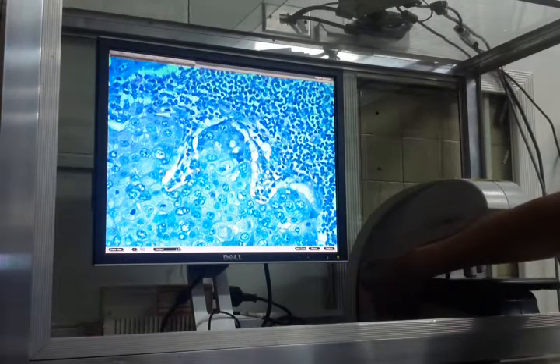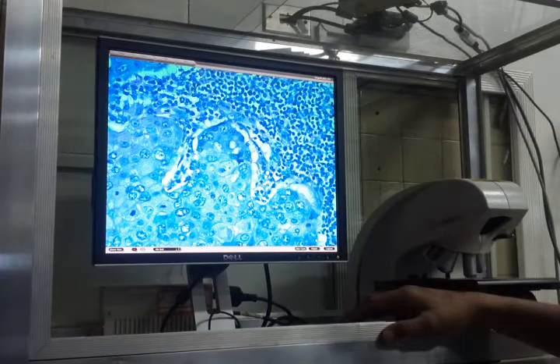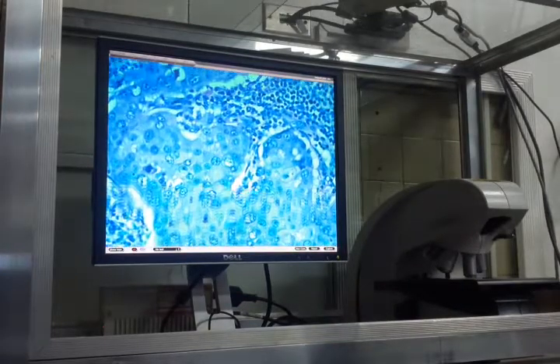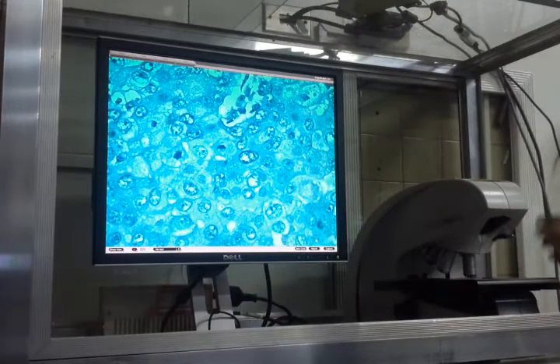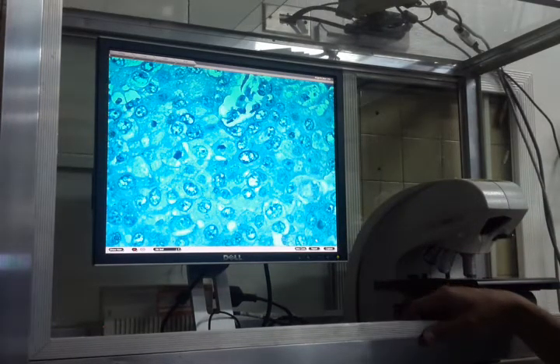And after lodging, they multiplied themselves by virtue of mitosis, which you see here. And they formed a secondary growth in that area. You don't call this simply a squamous cell carcinoma. Okay? This is metastatic squamous cell carcinoma.